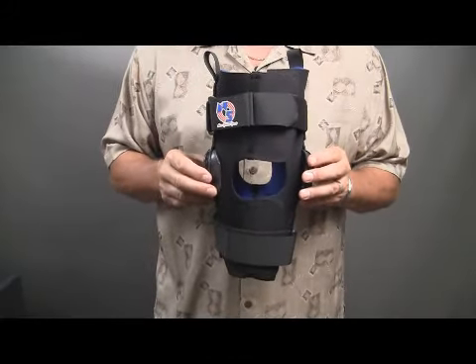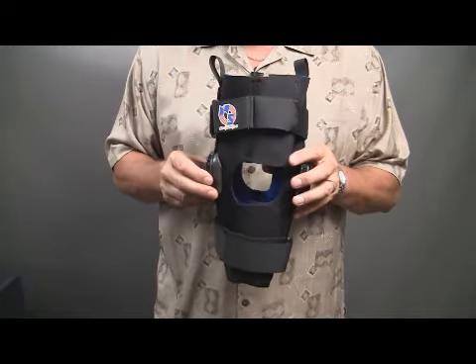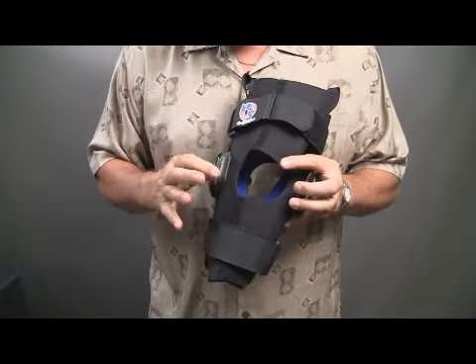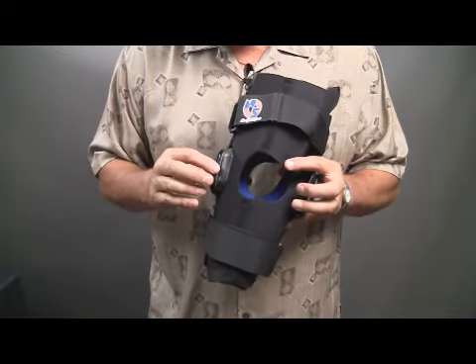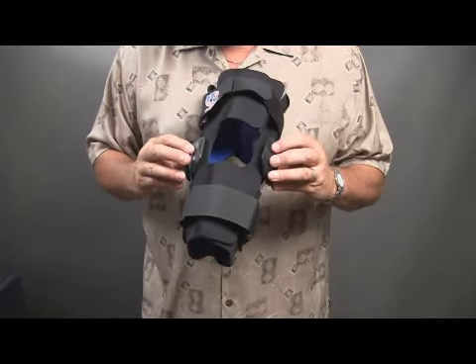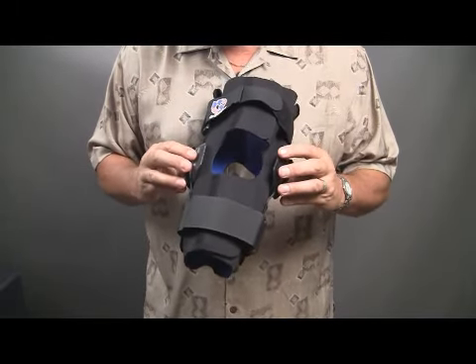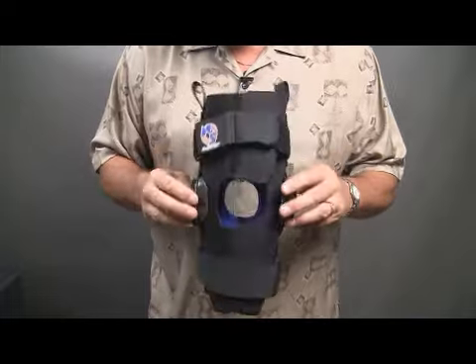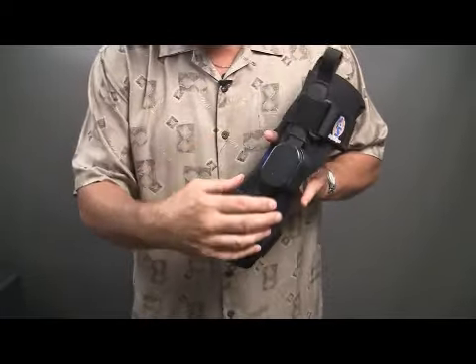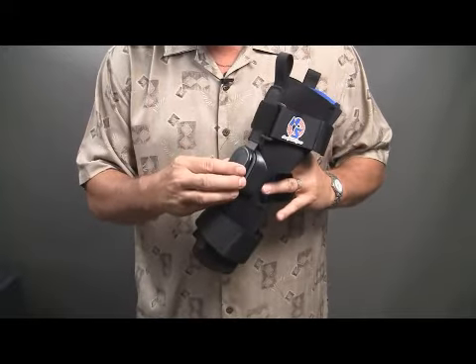Additional features and benefits for the K42 NOS Rehab Knee is the condyle rubber pads underneath the hinge. This protects the condyle so if you take a blow — they're cupped so they fit around the condyle comfortably. Both front and back just locks right around the condyle, a very important feature on this particular brace.